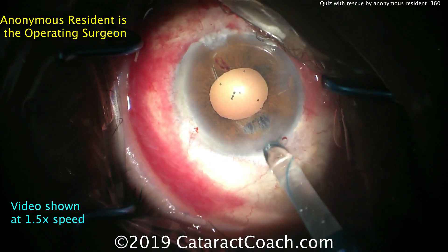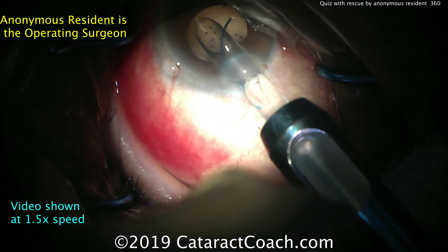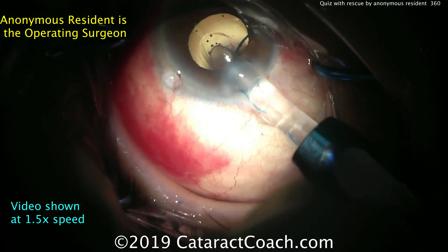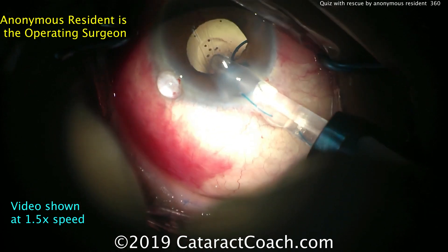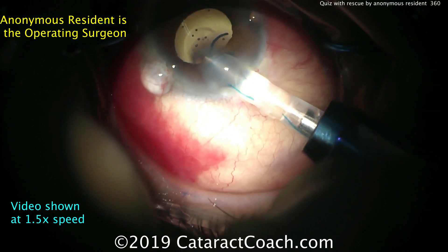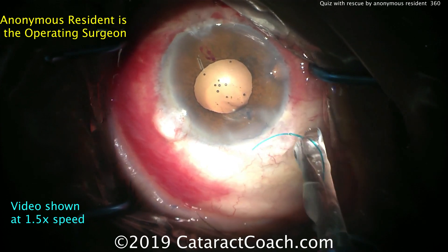There's a slight enlarging of the incision, which is helpful. Now the lens is going inside the eye — injector tip in, start to deliver the lens. Remember the 7L rule: the first haptic should come out looking like the number seven. This one is not, so okay, let's try the other way.